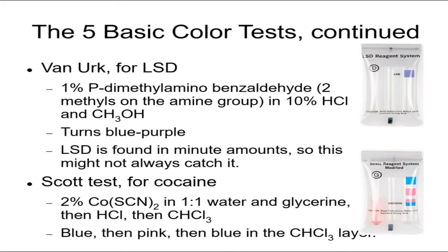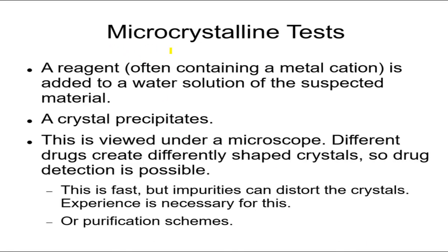Just like these color tests, microcrystalline tests are only presumptive tests. You need to back them up with another test. You can't just rely on them alone. You want to have a confirmatory test that will tell you exactly what it is.